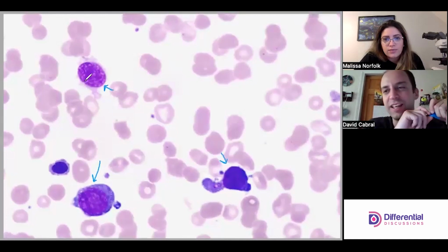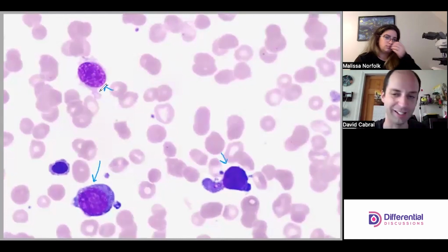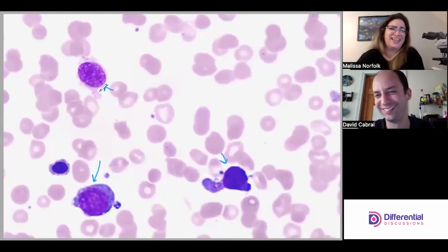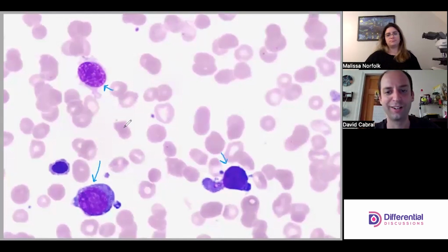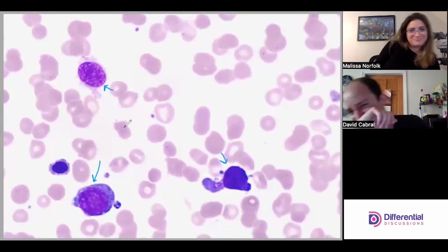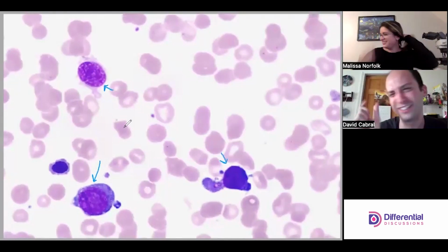I wish we had a picture ready so they could see. Look up megakaryocytes. They would roughly be about the size of this field, more or less. Probably take up like 70% of it. And what are the numbers, Melissa? What, 12 to 20 nuclei or something? 32 to 64. Oh, it was close, you know.